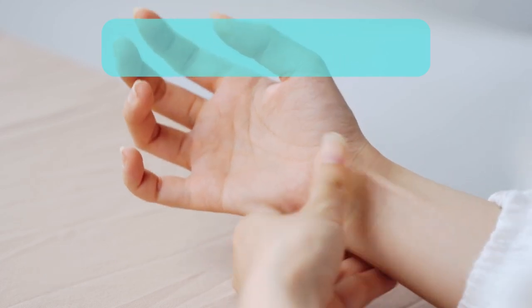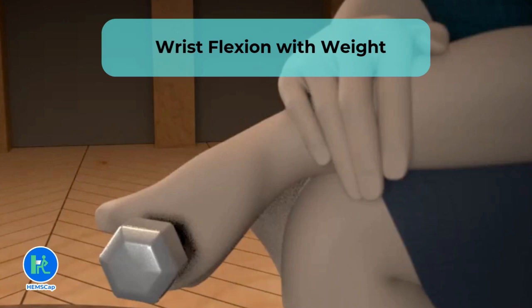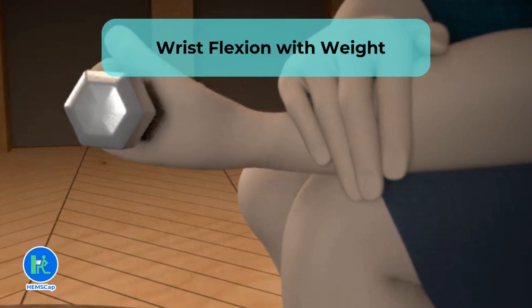By performing wrist flexion with weight 3 times, the patient can strengthen the wrist flexor muscles while the physical therapist evaluates range of motion and movement quality. Since this movement overlaps with assessments, it is used in the platform both as an exercise and as an assessment.